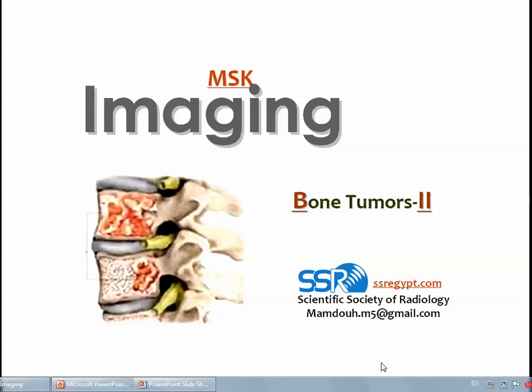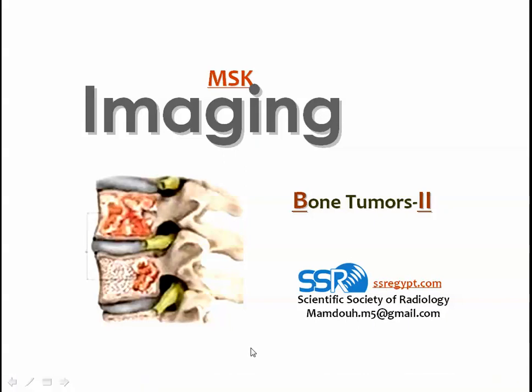Dear colleagues, now we will continue the topic of imaging of bone tumors, and we have classified the bone tumors into three main groups. The first group was that where the tumor can be spotted from the plain X-ray or CT or MRI, and it has almost no differential diagnosis.